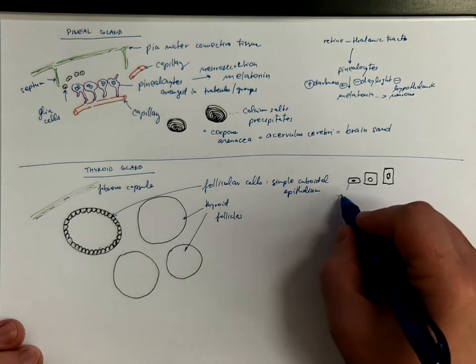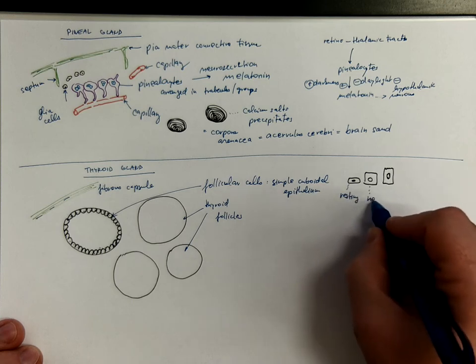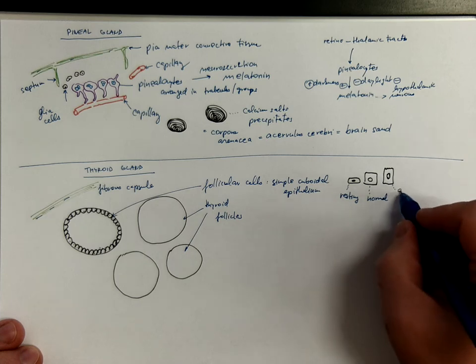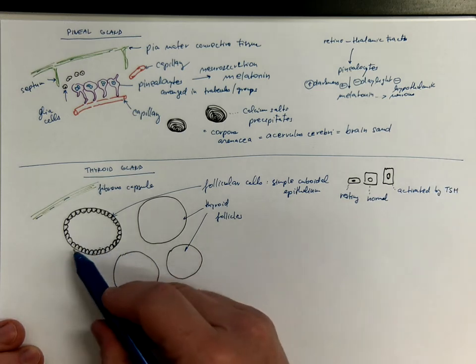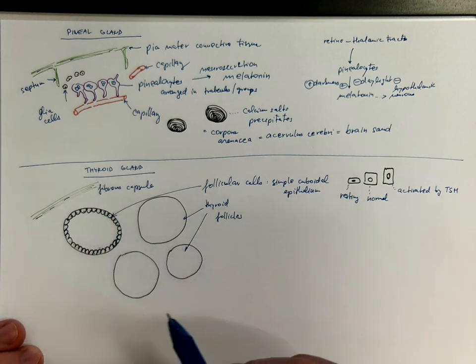This is resting, this is normal, and this is under activation by thyroid stimulating hormone of the adenohypophysis. But normally let us consider the cuboidal shape.